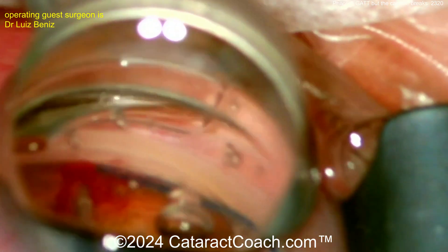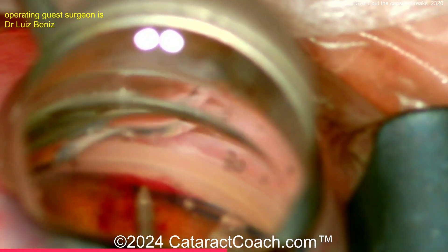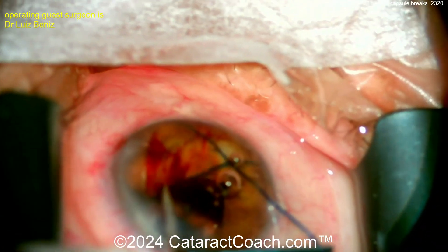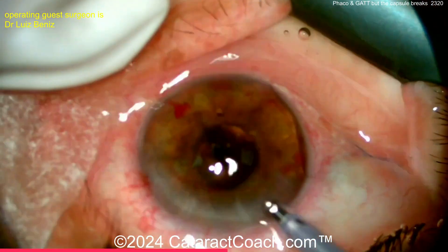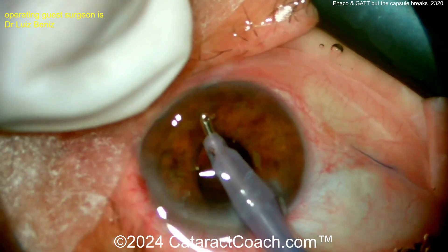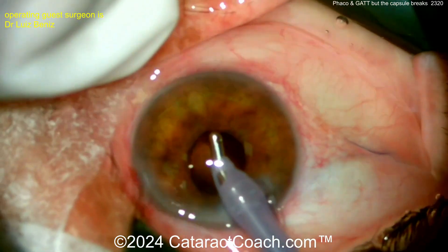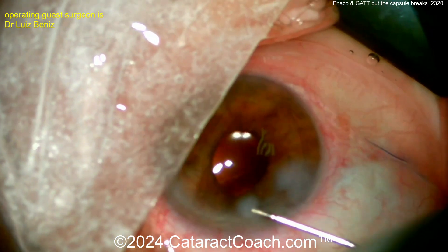Let's see what's going on — it looks like the end of the prolene came around. Grab the other end, grab them both, and pull it through. One, two, three — pull. And it's done. Beautiful. A little bit of bleeding is okay — don't worry about that. Take out the viscoelastic at the end of the case. The patient had a beautiful outcome. The cataract has been fixed, the vision is much improved, and the intraocular pressure is well controlled.